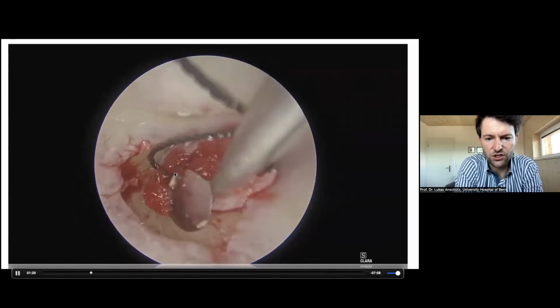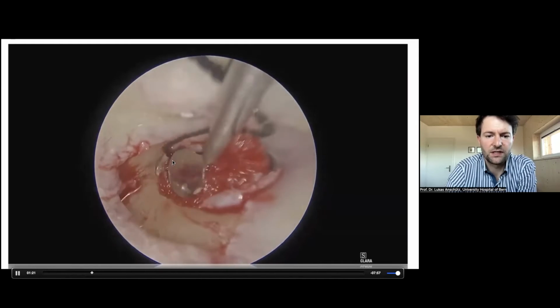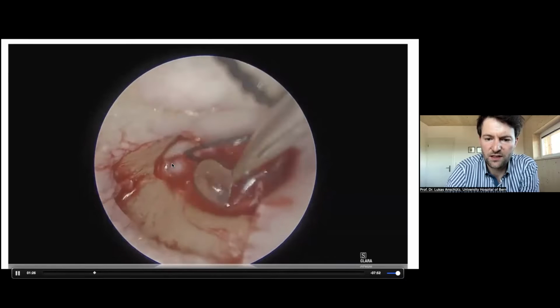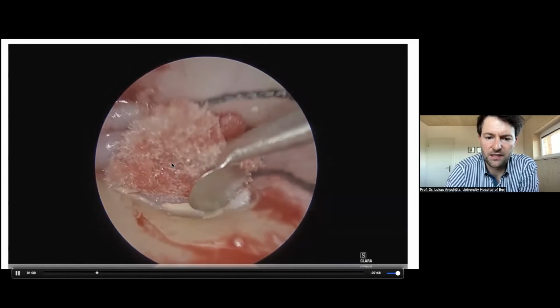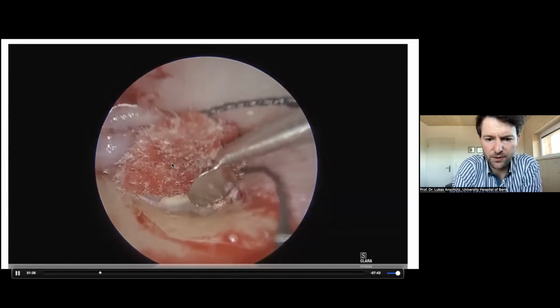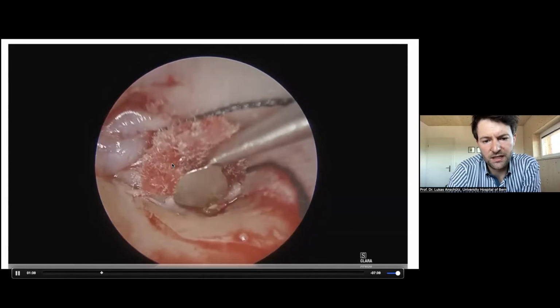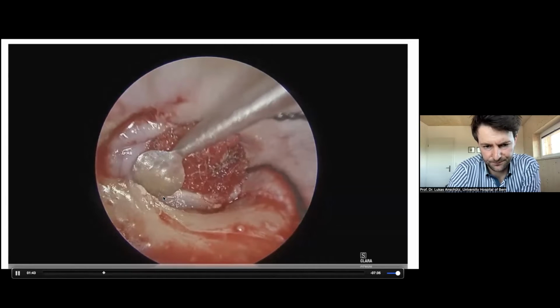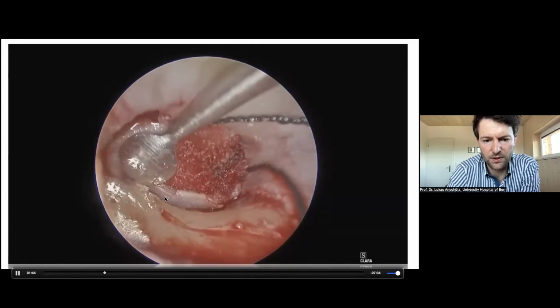And now we can reach the annulus. Here is already the cholesteatoma. And we can reach the annulus. You can see how beautifully it can be detached out of its bony crest. And we can open up the mucosa of the middle ear. You can see this now is the mucosa of the middle ear. We can cut it off with a needle.